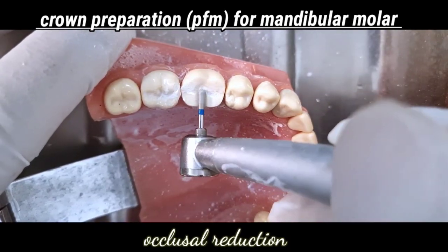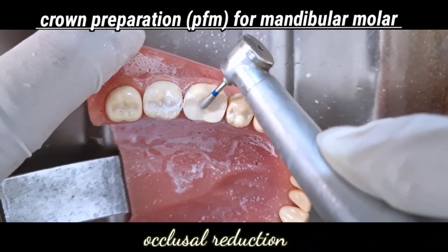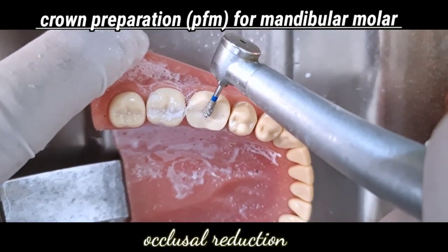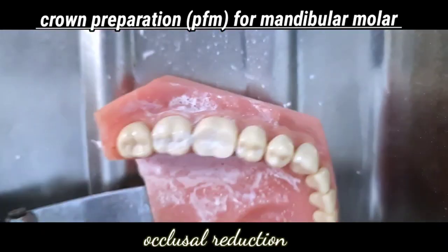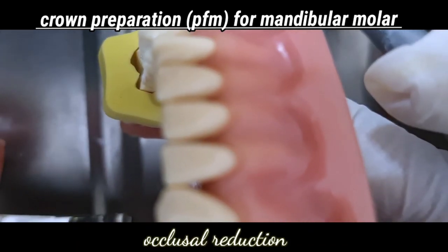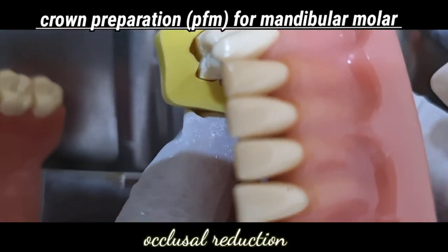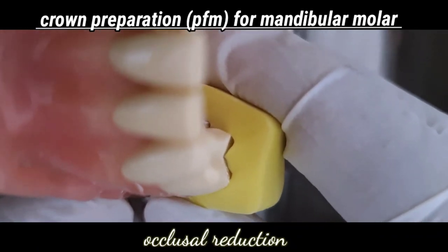Occlusal reduction is done one cusp at a time. Check the occlusal reduction with a putty index, and it should follow the pre-existing contours of the teeth. In case the teeth are worn, the cusp preparation is going to be relatively flat. Remember the rule: pre-existing anatomy. Check the preparation with a putty index and occlusal clearance with the opposing teeth. You can also take a bite record from wax to check the occlusal clearance from the opposing teeth.